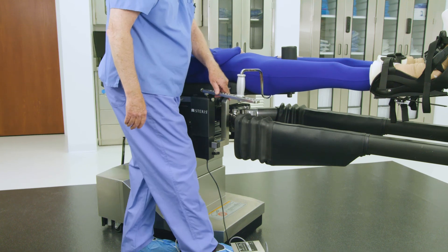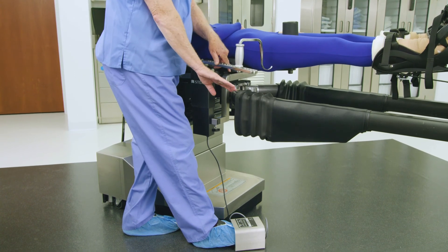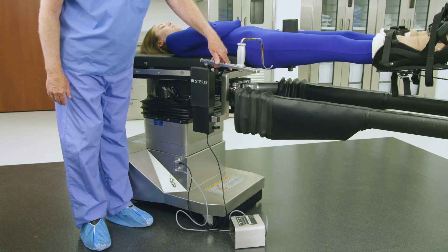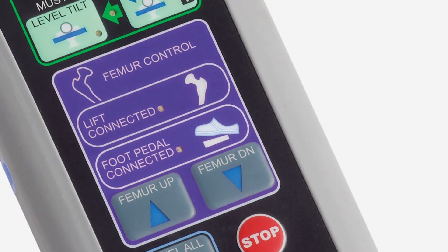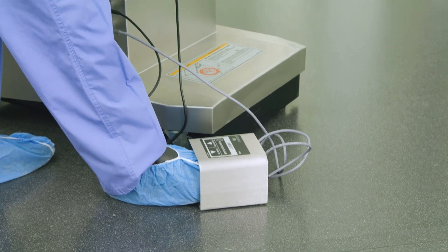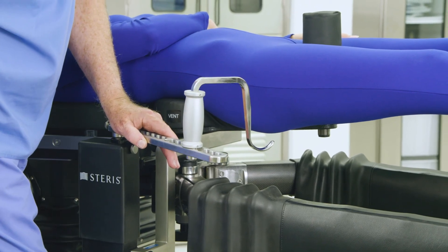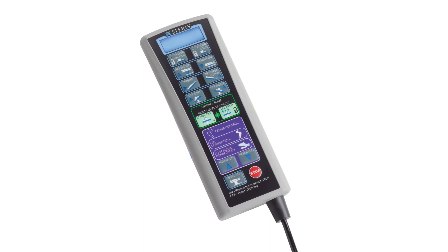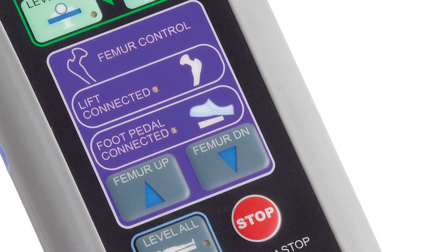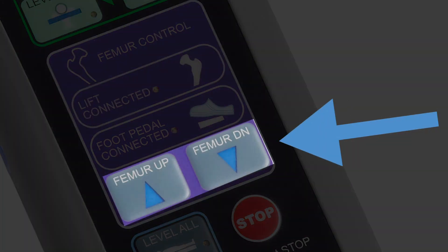To lift the femur positioner assembly and expose the femur for broaching, the femur positioner drive can be operated in two ways. The most common way is by surgeon-operated foot control. Verify that the green LED light next to 'foot pedal connected' on the primary hand control is illuminated, and press foot left or right on the foot pedal as desired to move up or down. Alternatively, you can use the table's primary hand control: verify that the green LED light next to 'lift connected' is illuminated, and press and hold the up or down button as desired.